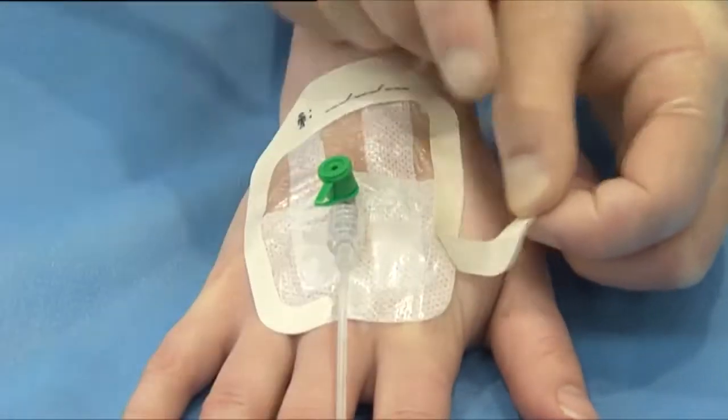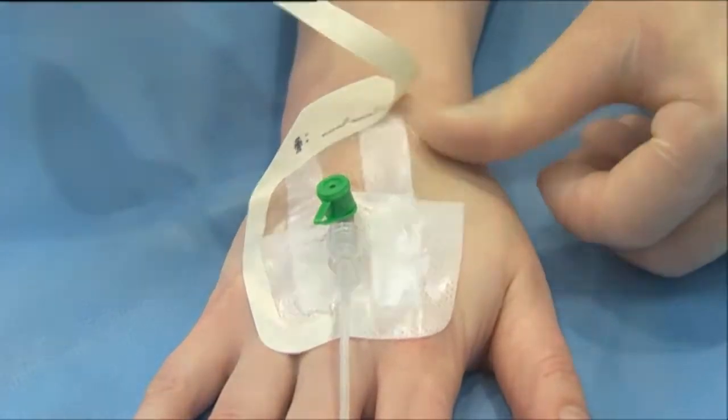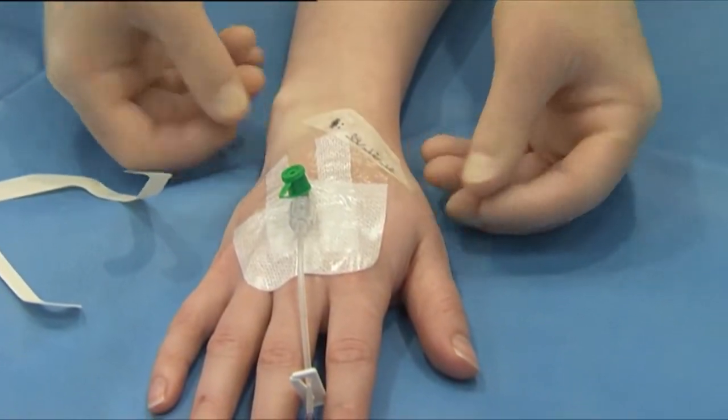Remove the paper frame, smoothing the dressing edges to increase adhesion. Place the date record label near to the dressing for documenting the dressing change.